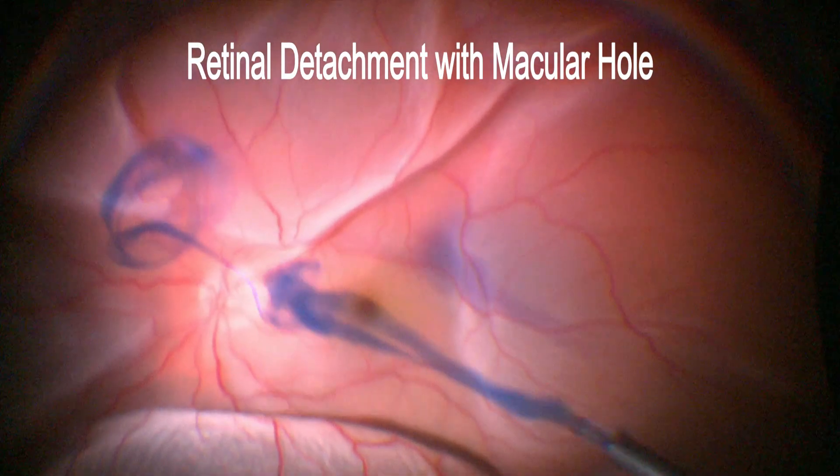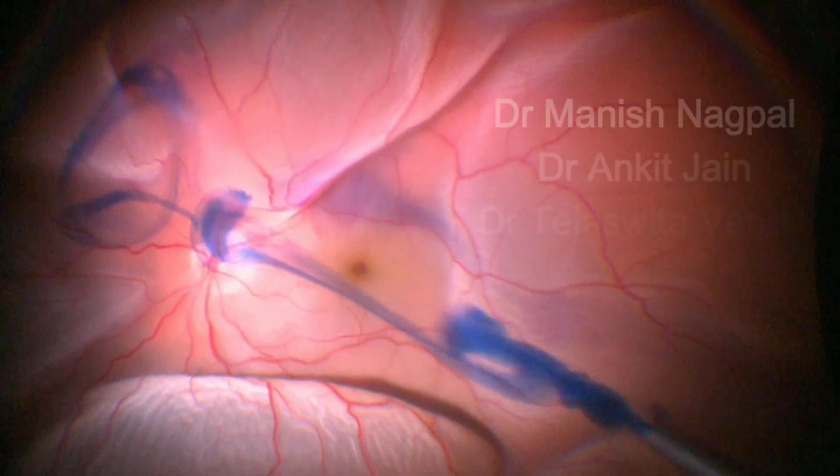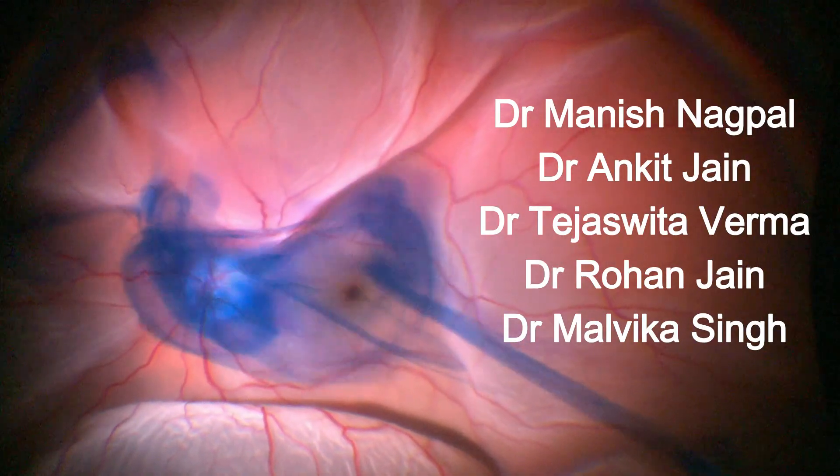This video highlights the management of a variety of cases of retinal detachments presenting with macular hole.